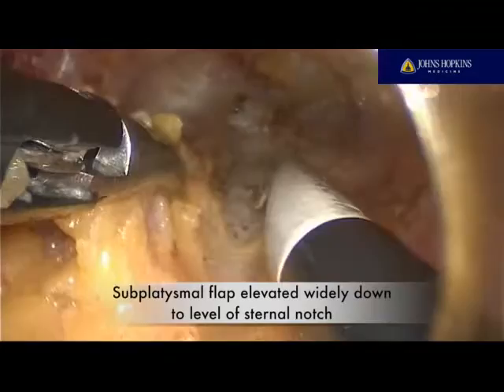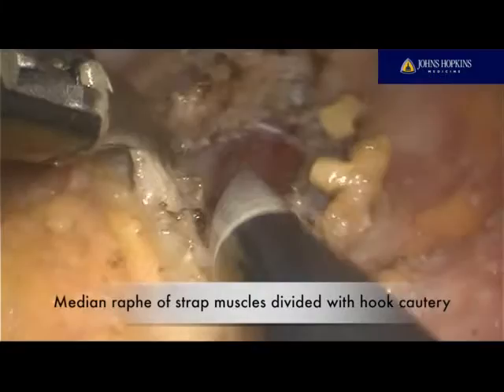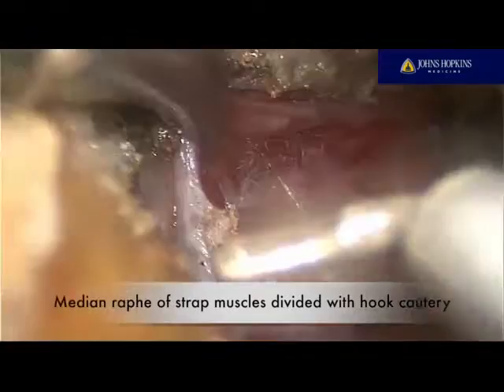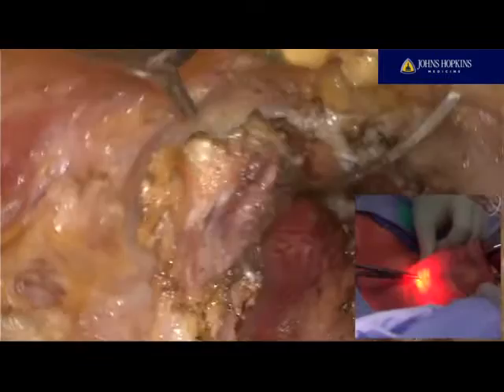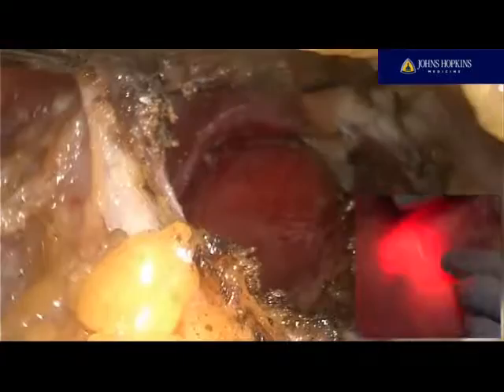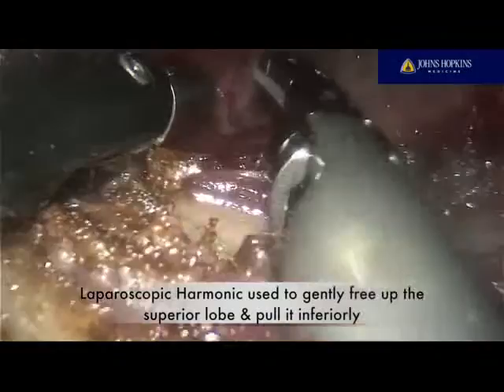Here we have the view in the subplatysmal plane looking at the median raphe, which is being divided with the hook cautery. A Maryland dissector in the left hand is used to grasp the strap muscles and gently elevate them anteriorly. Here the strap muscles are being bluntly dissected off the left thyroid lobe. A suture is passed transcervically through the strap muscles and back out through the skin in order to provide elevation of the strap muscles off the thyroid lobe.